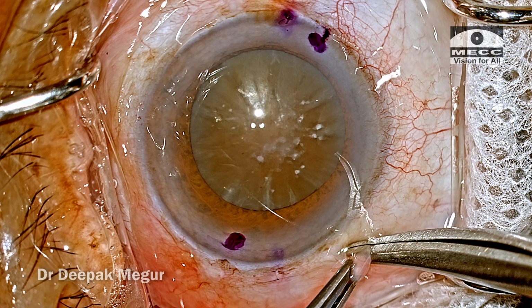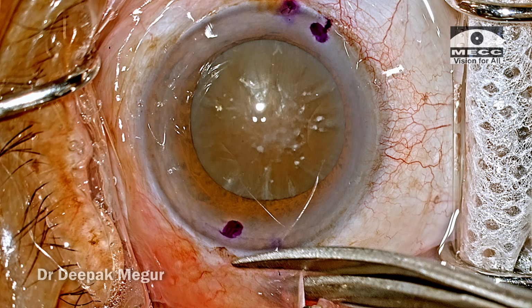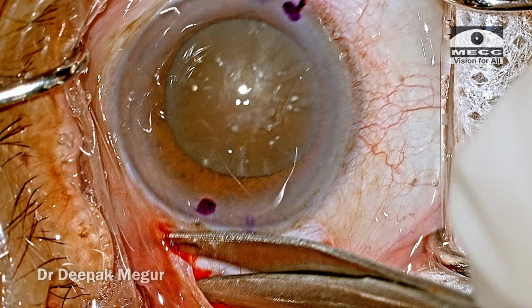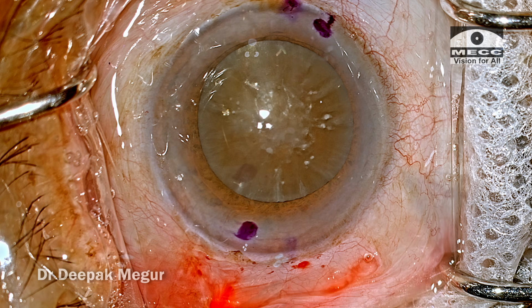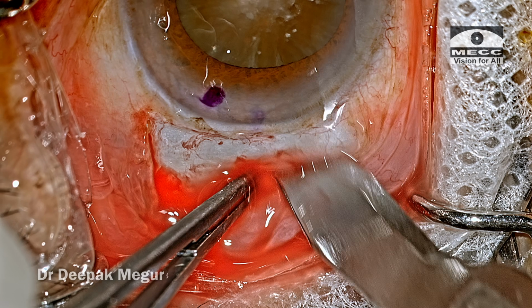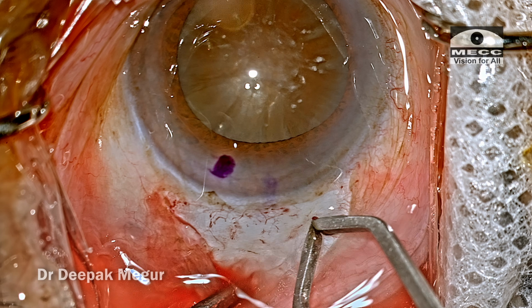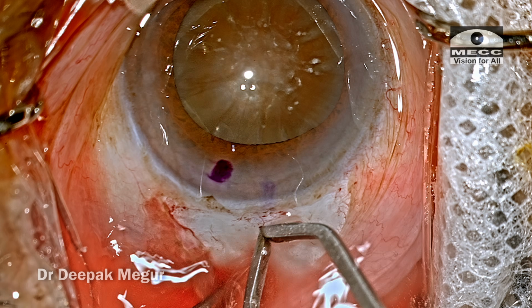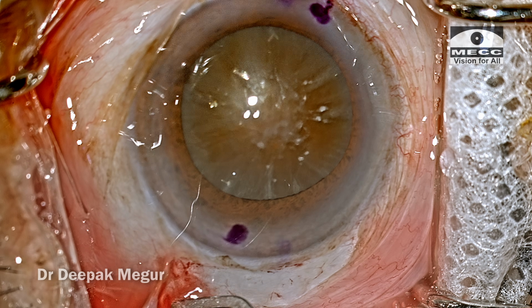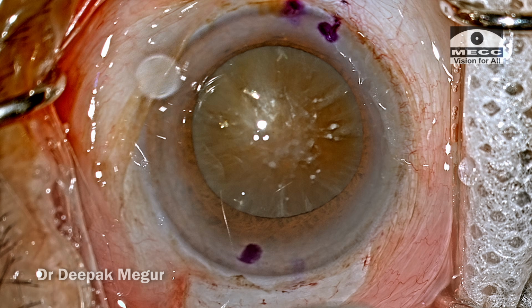I'm sitting temporally. The surgery is being performed under a peribulbar block. There is no superior rectus traction suture put. The conjunctival peritomy is performed using the scissors and the Hoskins forceps. The superficial episcleral tissue is scraped off using the number 15 blade, and then a gentle cautery is applied to the bleeders. Mind you, we need to avoid excessive cautery. Just identify the bleeder vessels and cauterize them individually rather than doing a carpet bombing like cautery throughout.